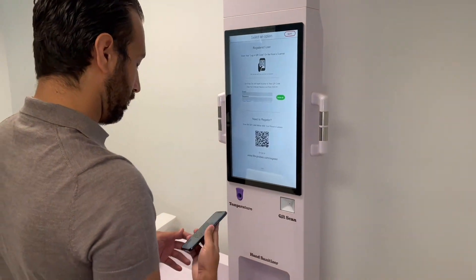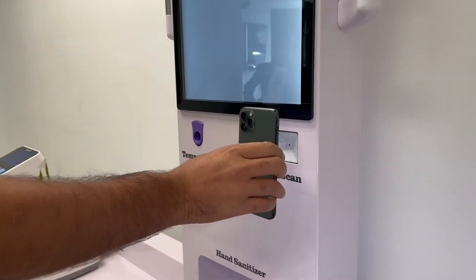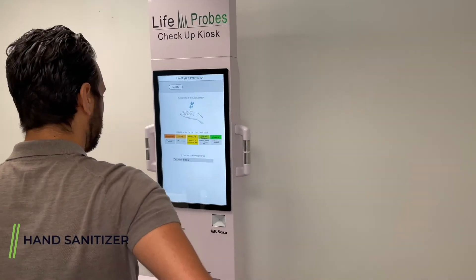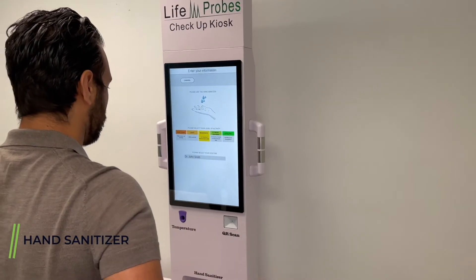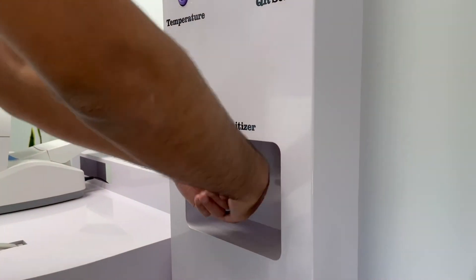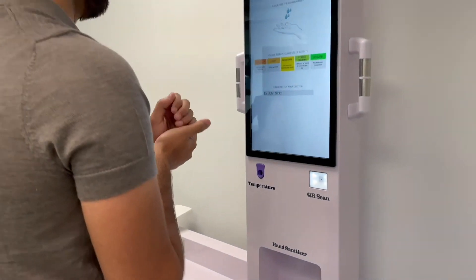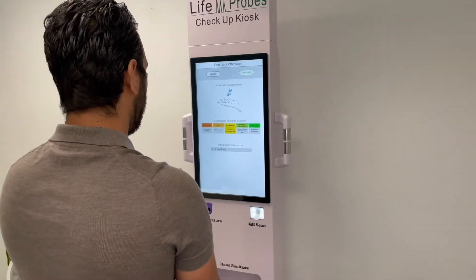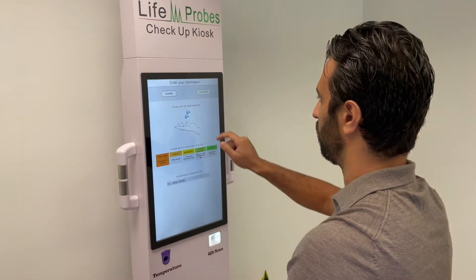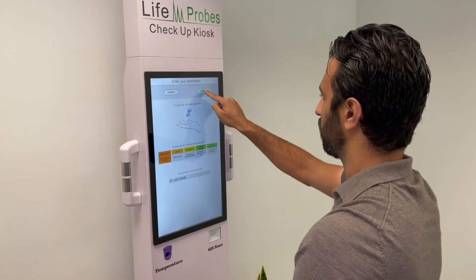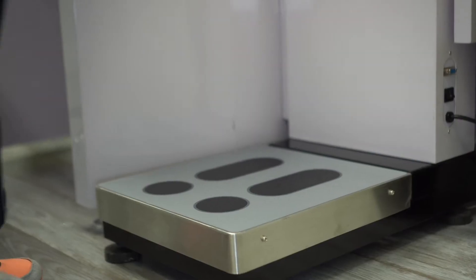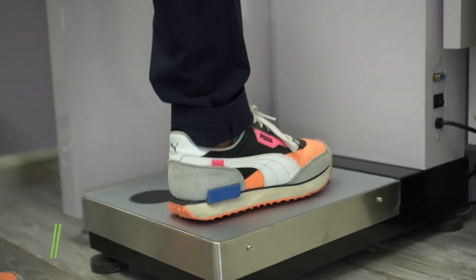Welcome to the Lifeprobes Kiosk. Please log in by scanning your QR code, or go to lifeprobes.com to register. Please use the hand sanitizer before continuing. Select your level of activity and the name of your medical doctor, then press the continue button.